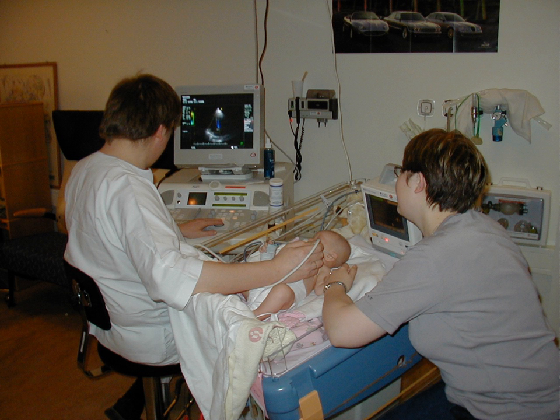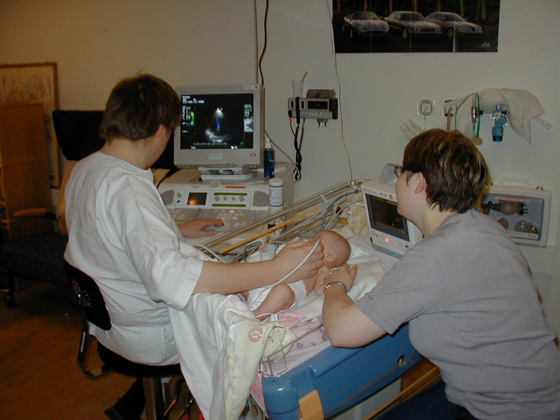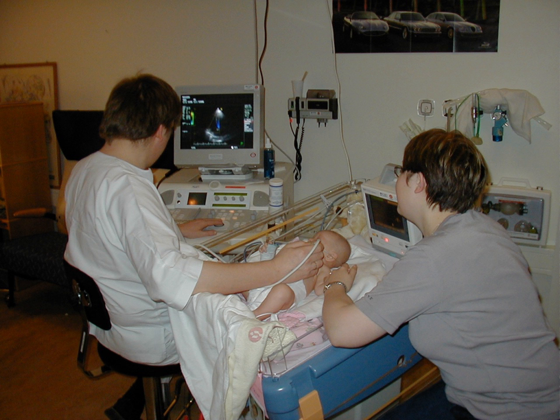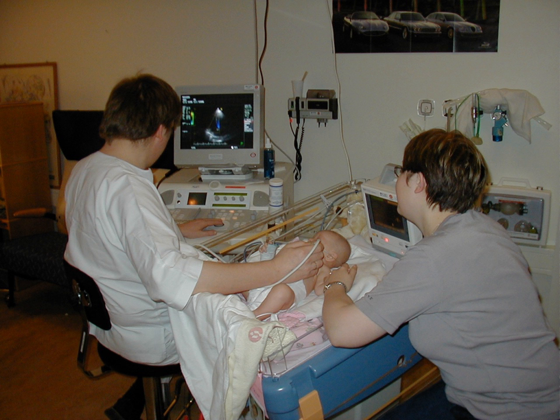In B-mode (brightness mode), a linear array of transducers simultaneously scans a plane through the body, viewable as a two-dimensional image on screen — more commonly known as 2D mode. B-flow is a mode that digitally highlights moving reflectors, mainly red blood cells, while suppressing signals from surrounding stationary tissue, allowing visualization of flowing blood and stationary tissue simultaneously — an alternative or complement to Doppler ultrasonography. C-mode forms an image in a plane normal to a B-mode image, using a gate to select data from a specific depth, then moving the transducer in a 2D plane to sample the entire region at that fixed depth; scanning a 100 cm² area takes about 10 seconds.